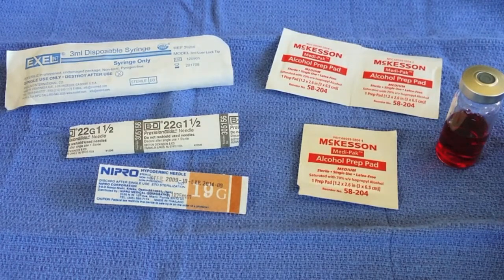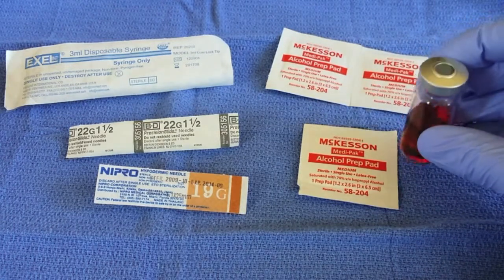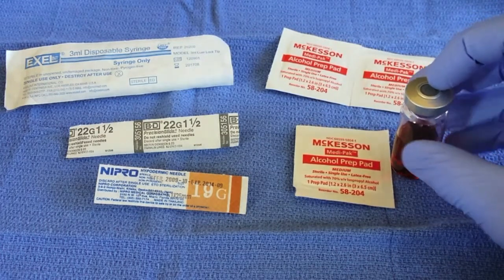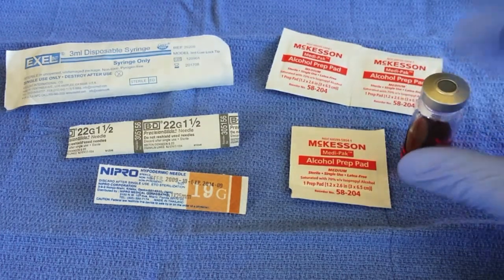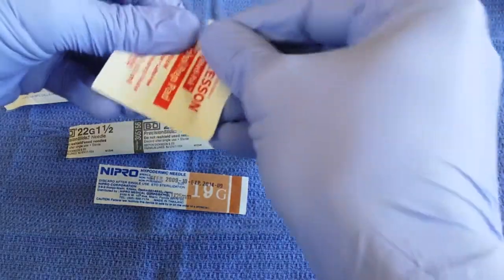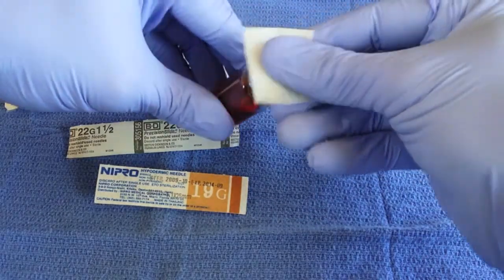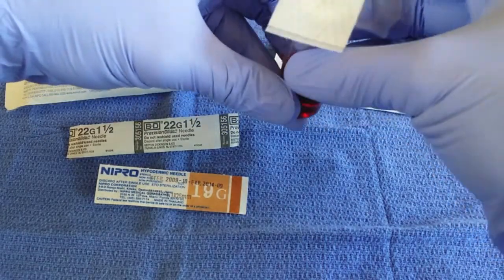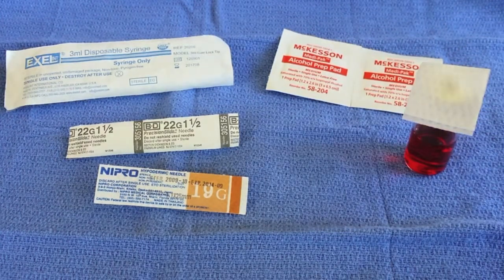The first step in preparing our injection for administration is going to be cleansing our vial. This vial has already been opened. Oftentimes you'll see a metal cap or a plastic cap on top of the vial — you would remove the cap and this is what you'll see. We're going to take one of our alcohol prep pads and simply clean the top of that vial. We can actually leave the alcohol prep pad on there while we continue to assemble the rest of our supplies for administration.